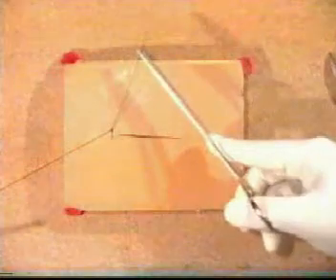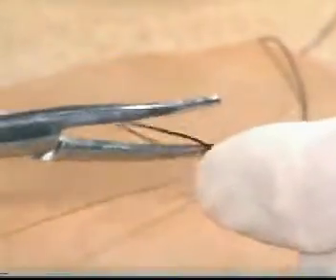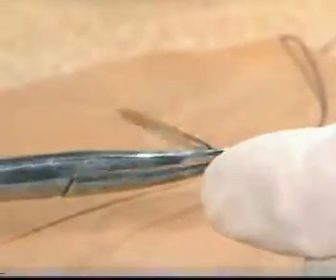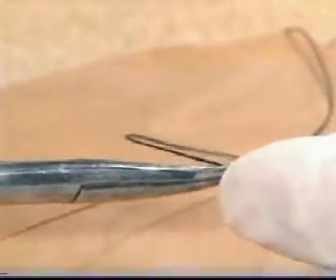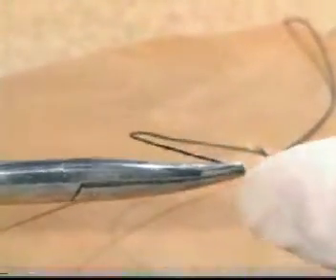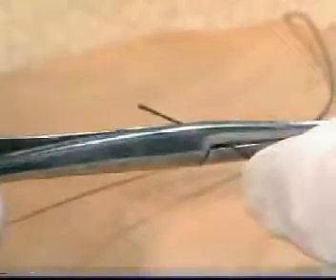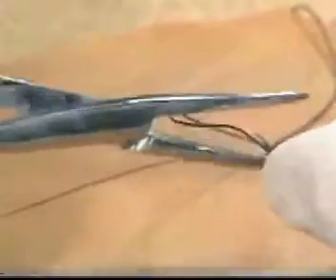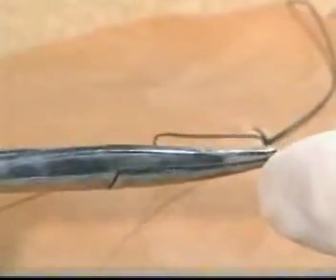In this situation, let us assume that we wish to maintain a hold of the end of the short suture as a stay. In this case, get your assistant to place a hemostat on the end of the suture, grasping it right at the tip of the jaws, not up near the hinge where it would slip.